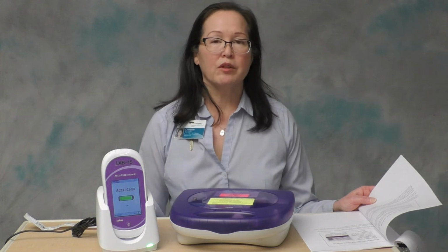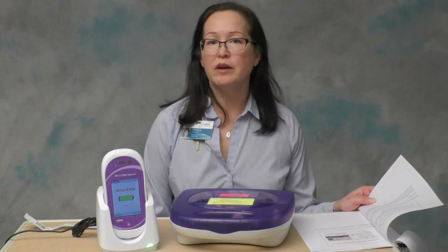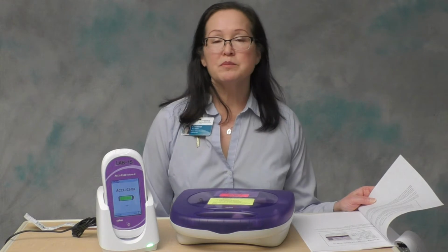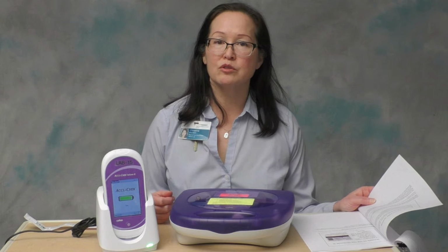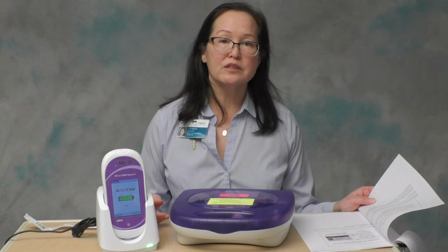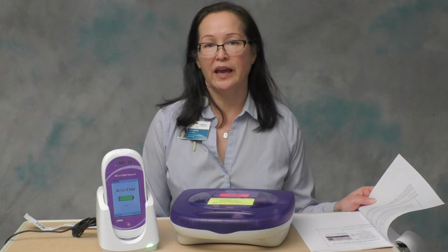The testing has to be authorized by the lab's medical director, and here in our facility we have a full-time pathologist on staff that oversees all of laboratory medicine, including point-of-care testing. Users must be trained and certified, and that's what we are doing here today: your initial training and certification for glucose testing by the Inform 2 meter. In addition to your initial training and certification, you have to maintain competency annually.